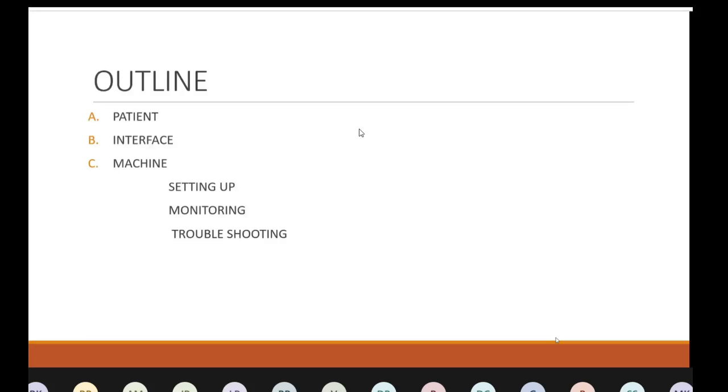So how do you learn to use non-invasive ventilation rightly? The most important thing in using non-invasive ventilation rightly is avoiding leaks. So that is the most important thing. Leaks are what causes most of our non-invasive ventilation to fail. So you have to really work on decreasing these leaks. How will we decrease leaks? So this is an orofacial mask. It covers the nose and it covers the mouth.